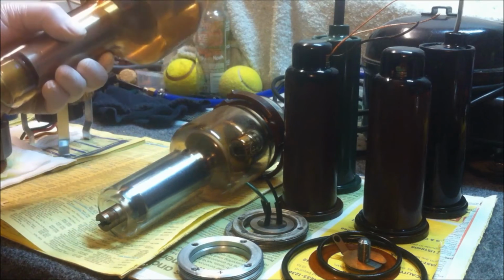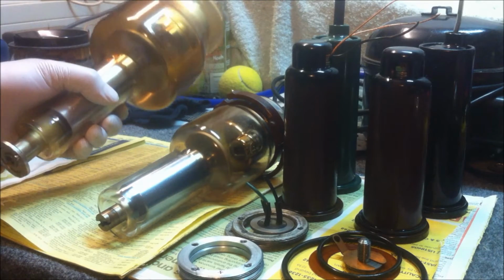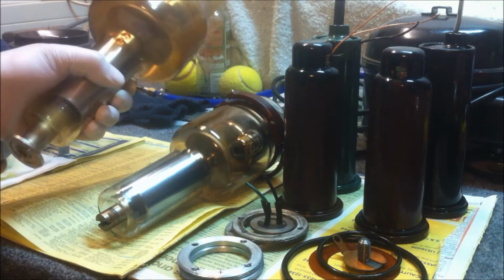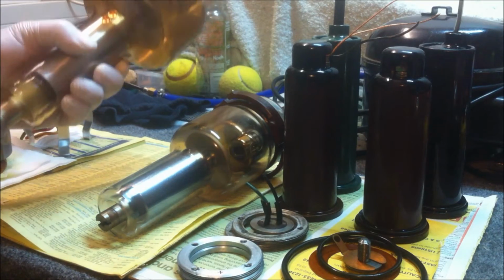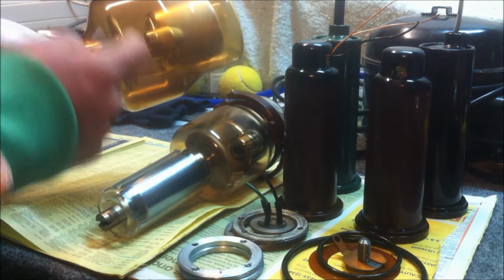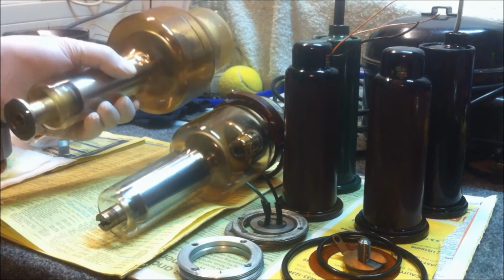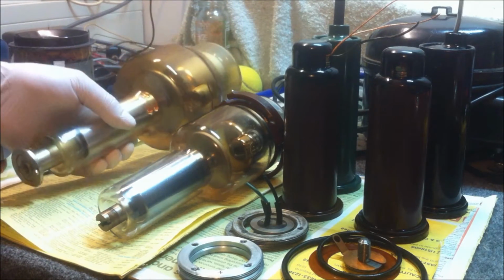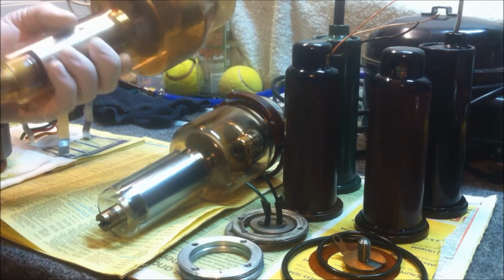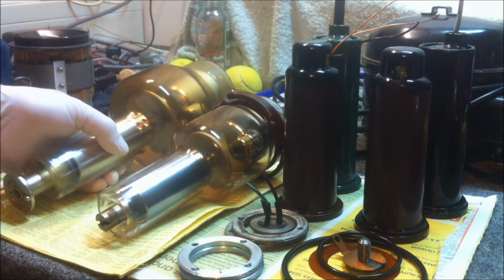This big one here came out of the spare X-ray head that I found sitting in that big crate or steel cage down at the scrapyard. It's pretty massive. It's a rotating anode, so this thing actually rotates, rotating that tungsten target on the top there, and that'll spin at about 10,000 RPM, maybe even more. And you can see that they've drilled it out to get it all balanced and working smoothly to minimise the heat in the actual tube itself to prolong the life of the tube.